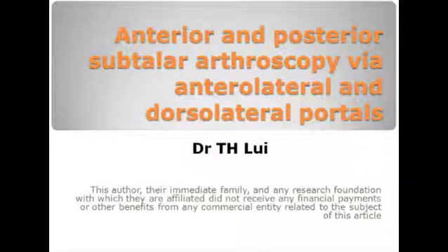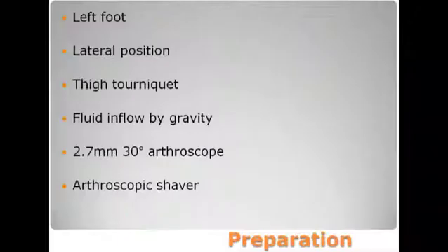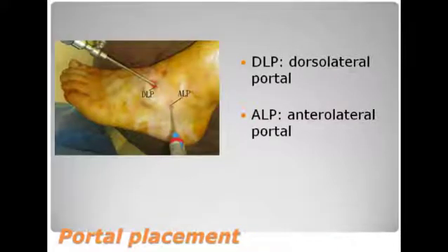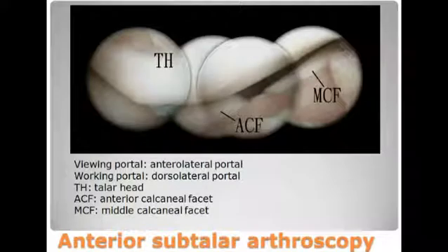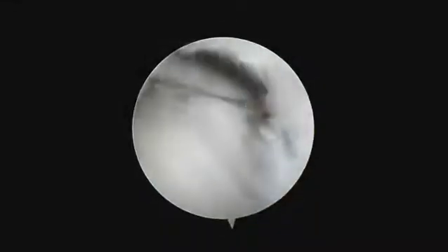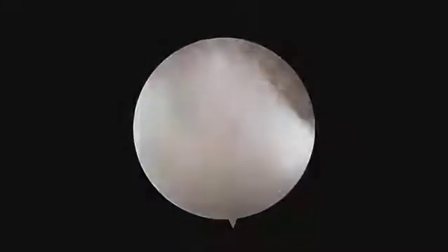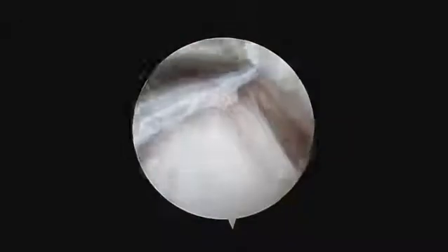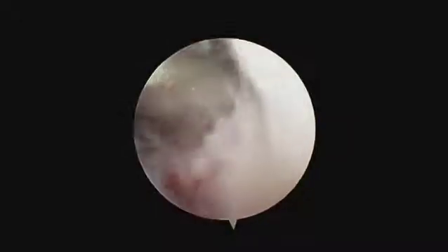Anterior and posterior subtalar arthroscopy through the dorsolateral and anterolateral portals. Anterior subtalar arthroscopy is performed with the anterolateral portal as the viewing portal and the dorsolateral portal as the working portal.